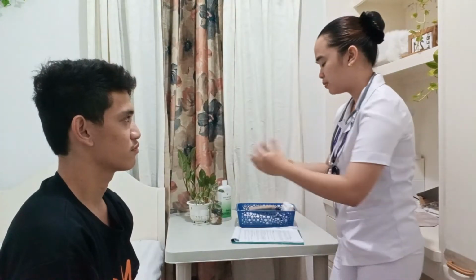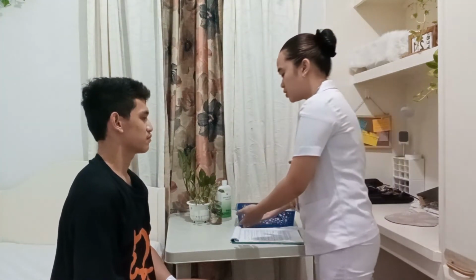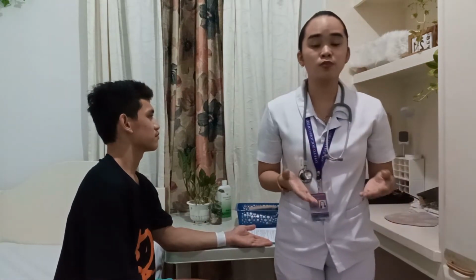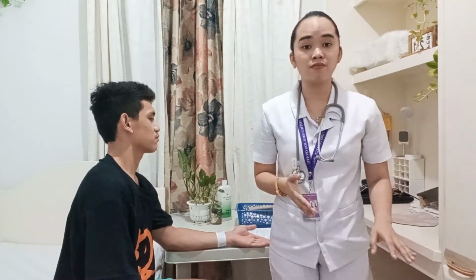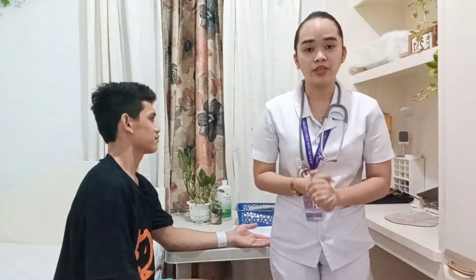Okay, can you move here please, Mr. Patrick? Since the patient is in sitting position, we must make sure that his feet are on the ground because blood pressure will increase if the legs are crossed. Okay, can you put your arms here on the table, please? Also, his arms must be at heart level, because if the arm is at a lower level, it will give us a high blood pressure reading, and if the arm is at a higher level, it will give us a low blood pressure reading.